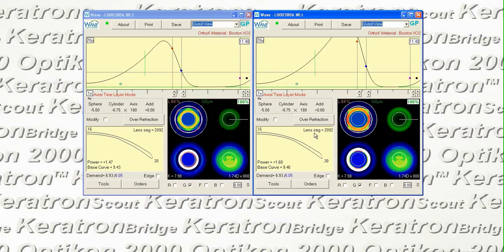For the right eye, it's going to be more difficult because the patient's a little bit undercorrected right now. And if we do need to increase topo demand for the right eye, that will probably negate any improvement to optic zone size that we get by altering the OZ and IC position, because as we increase the demand, it's just going to push this graph forward. So I think in the right eye, we might be at a best case scenario already, and that is maintaining the current treatment zone size, but adding a little bit more topo demand if we need to.